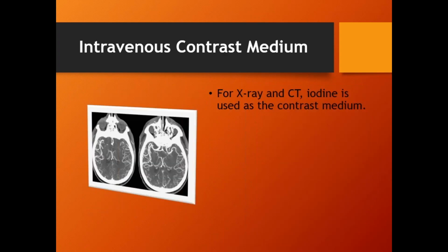Now, for angio and CT injectors, those are both X-ray systems. They're different kinds of X-ray systems, but they both use X-rays to produce the images. The main ingredient in this syringe is iodine. It's not the red iodine that your mom put on your scraped knees. I was actually a BMET when I found out, oh, I thought iodine was red. Nope, they put something else in that. But yes, the main ingredient in contrast fluid for angio and CT injectors is iodine.